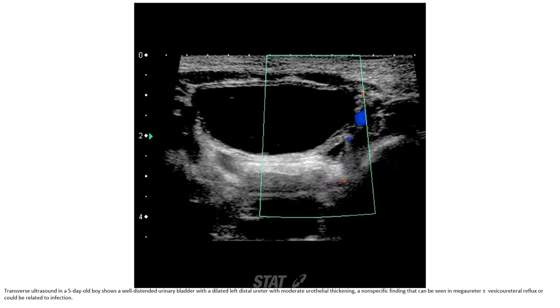Ultrasound in a 5-day-old shows a well-distended urinary bladder with dilated left distal ureter with moderate urothelial thickening — a nonspecific finding that can be seen in megaureter, plus or minus vesicoureteral reflux, or could be related to infection.